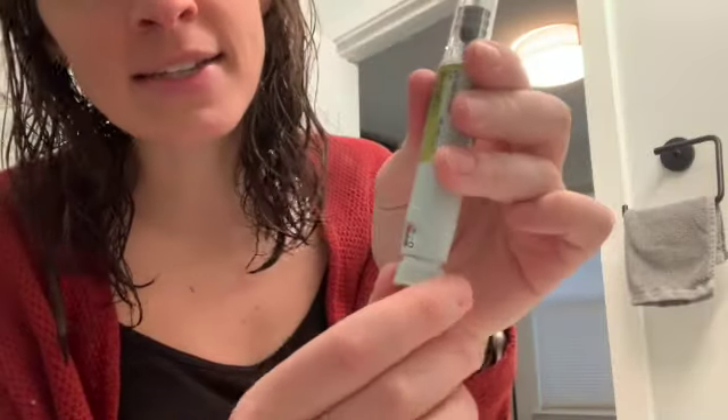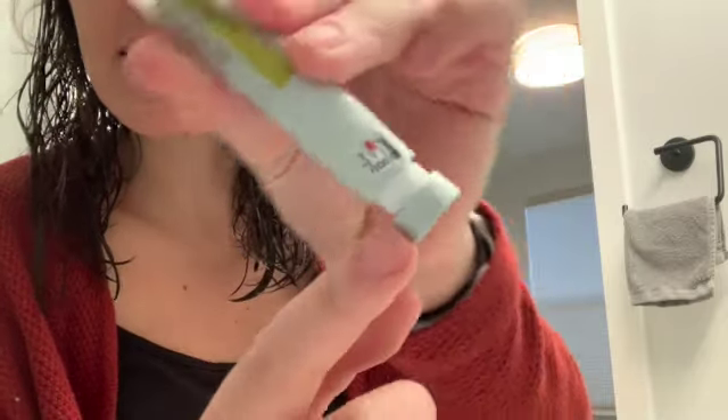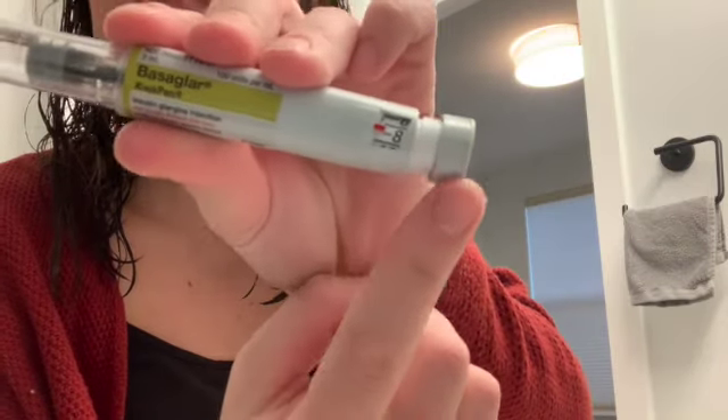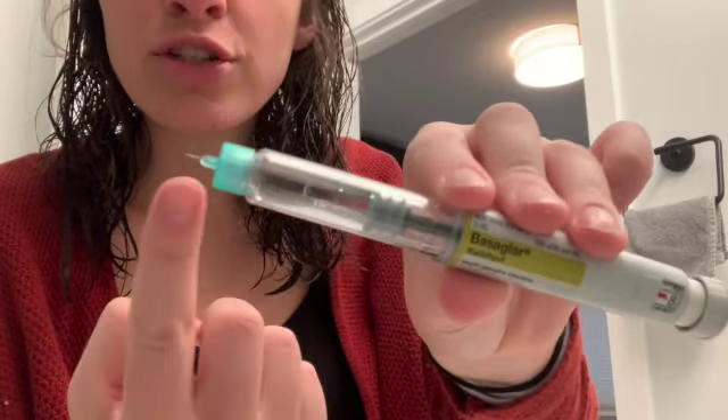Pull it off — you'll see there's a little protective cap here. Be careful. I've done this several times where I'm moving too fast and I take off that protective thing and I poke myself. So make sure you don't do that. Now I'm going to move this to eight units. You can see it says eight here — it's going to push eight units of insulin into my arm.